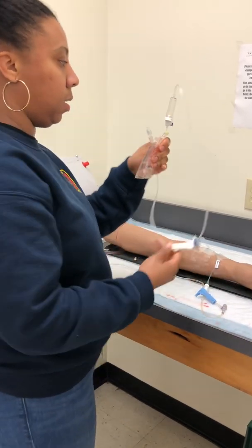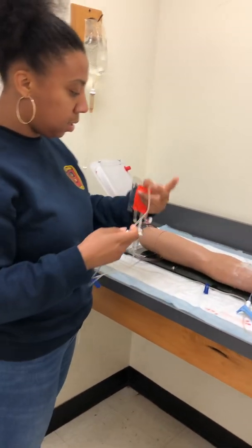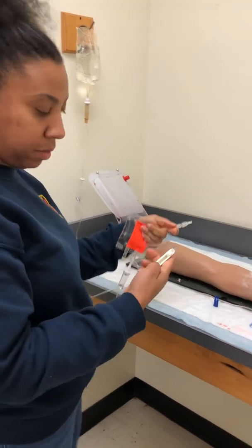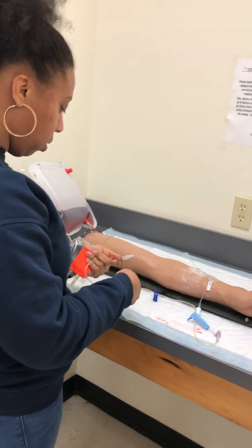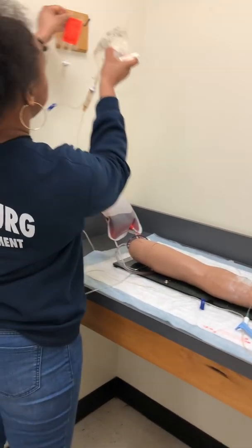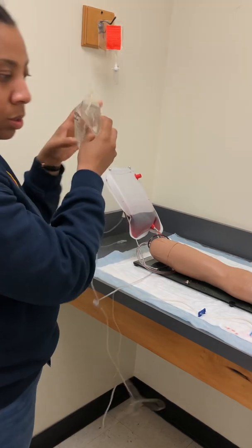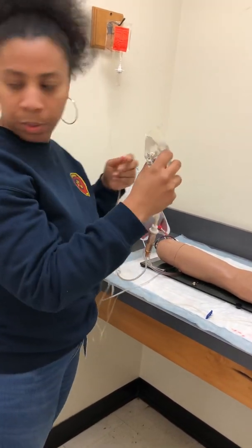Okay. And I will prime my tubing. Keep the top on, but just open it up so I can get all of the air out of the lining without wasting any medication. So once I prime it, all right, cut it off. I will put that up here. I would drop my primary fluids.